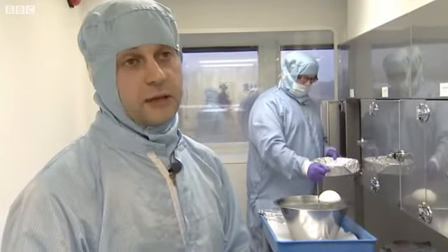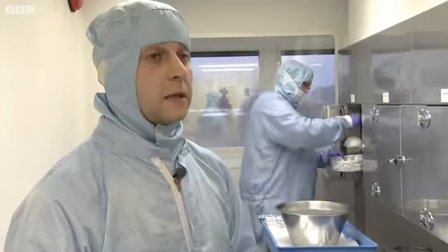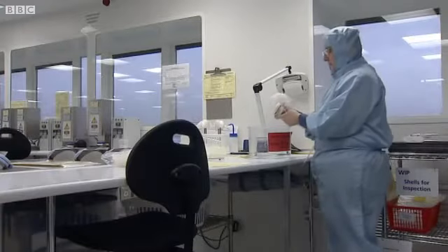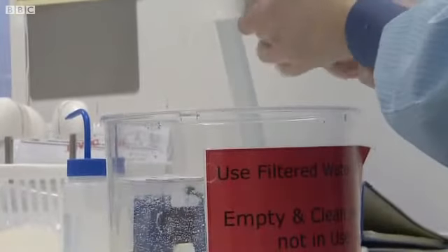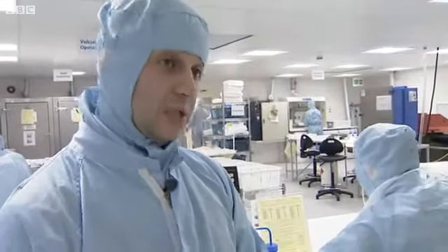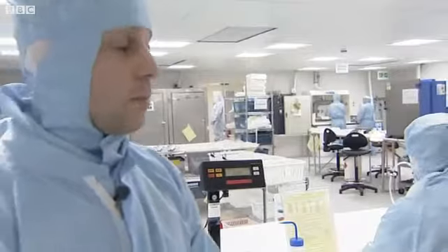it's inspected for 3 key parameters. It's inspected visually, it's inspected for leaks by water submersion, and it's inspected for thickness. The leak testing should identify whether there's any holes or any weaknesses within the shell. So having stripped the shell, inspected the shell, we then have to vulcanise the shell, which basically seals the hole that was created during the stripping operation. And that's done through the vulcanisation operation.